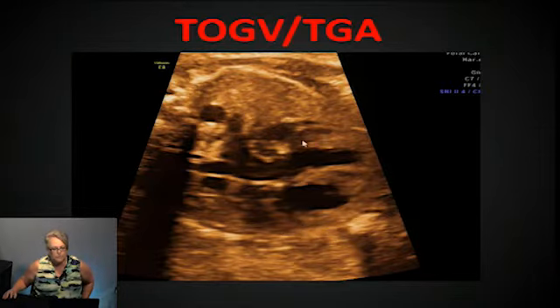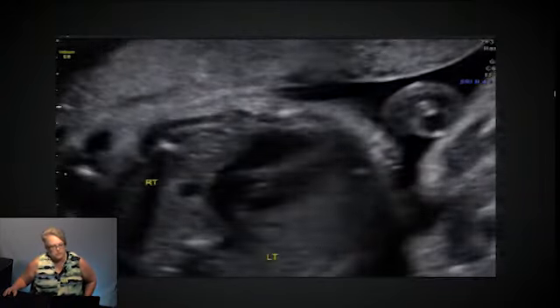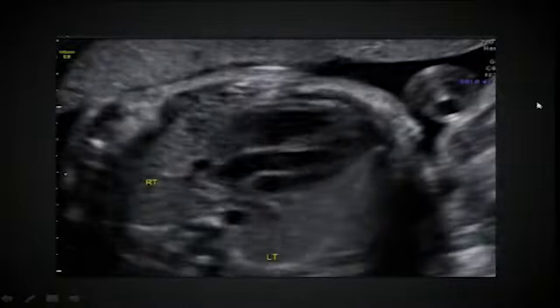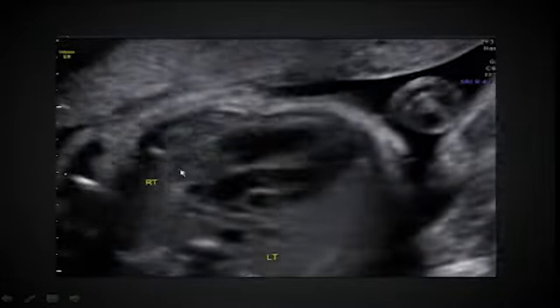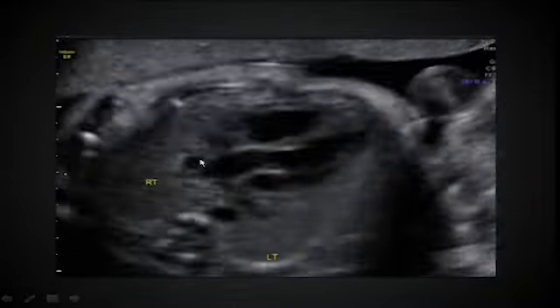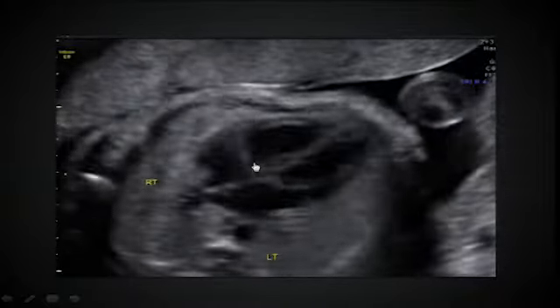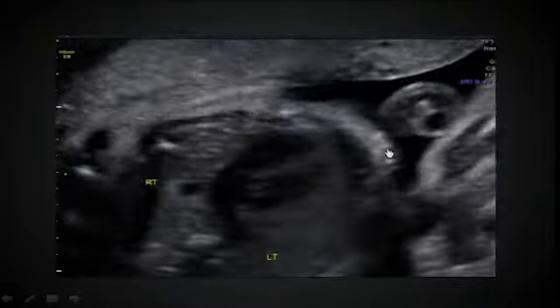So again, looking at the left ventricle, this vessel comes out and bifurcates right away. That's the morphologic pulmonary artery arising from the left ventricle. And then this in real time. So we have right ventricle, left ventricle. That's the aorta arising from the right ventricle, and this one bifurcates right away, so that is your pulmonary artery. It's important to look at those vessels as they're coming out: which one is connected to what ventricle, and are they connected to the correct ventricle?